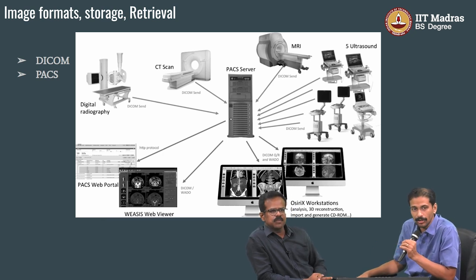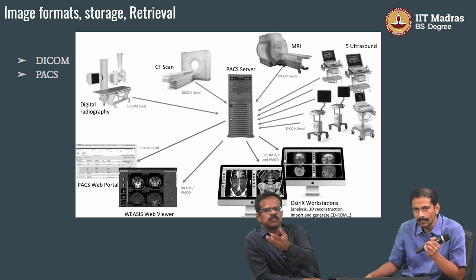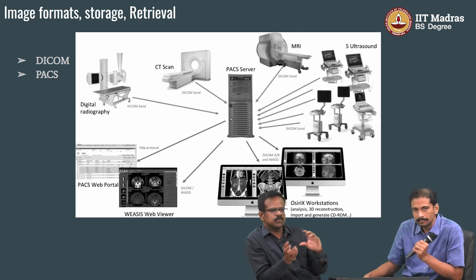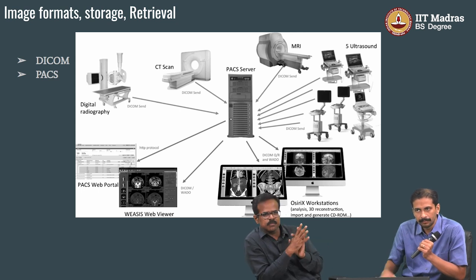That is by an international consensus. Previously, there were so many companies, Philips, GE, and each one created its own image format. They were not talking to each other. Then the international experts reached a consensus: we have to save in a particular format, which they called DICOM. There are DICOM versions 1, 2, 3, like your Python is evolving. This is also evolving, but there is a consensus. Worldwide, this is the format.